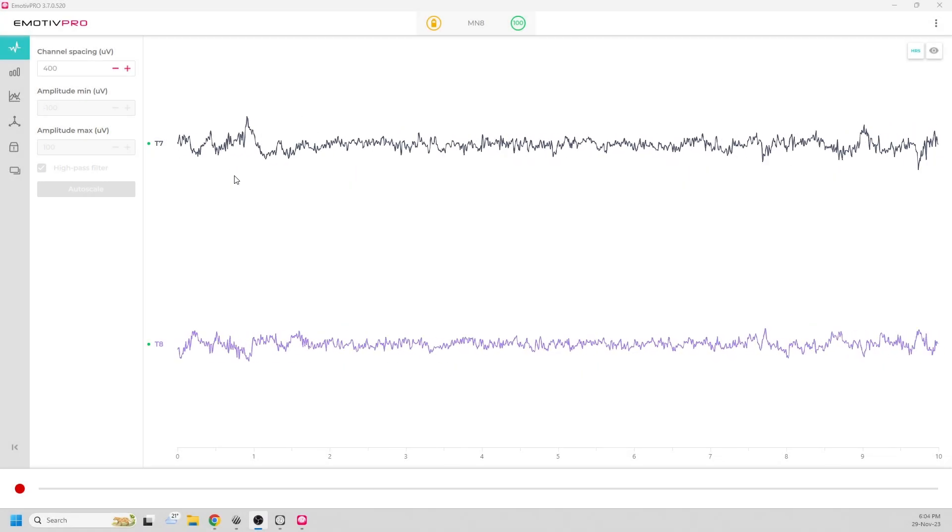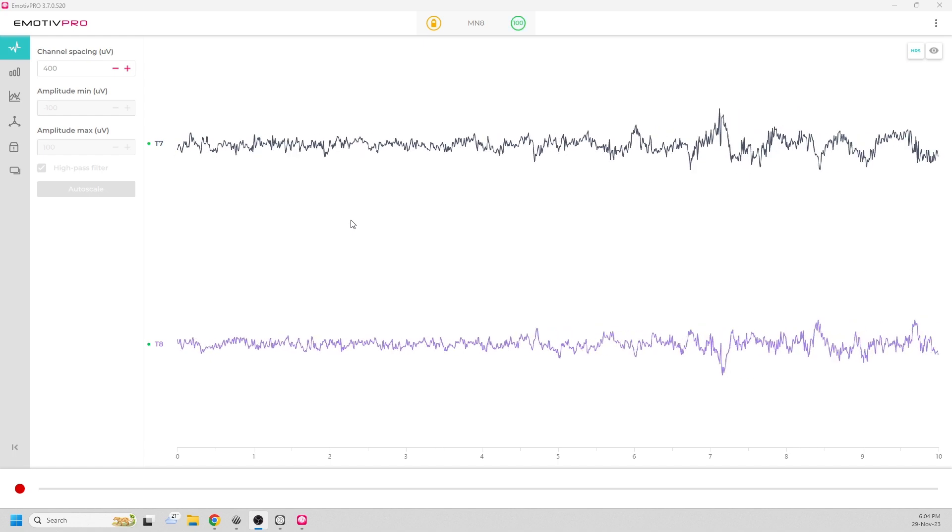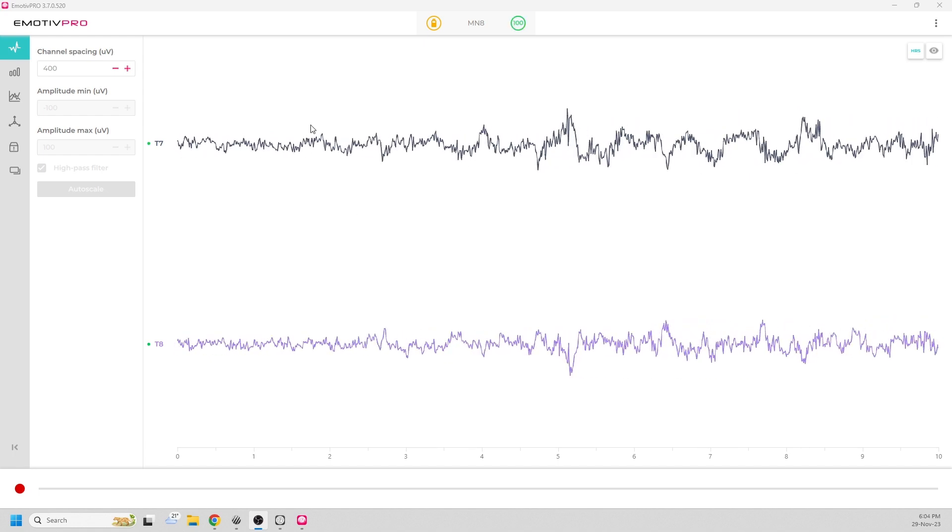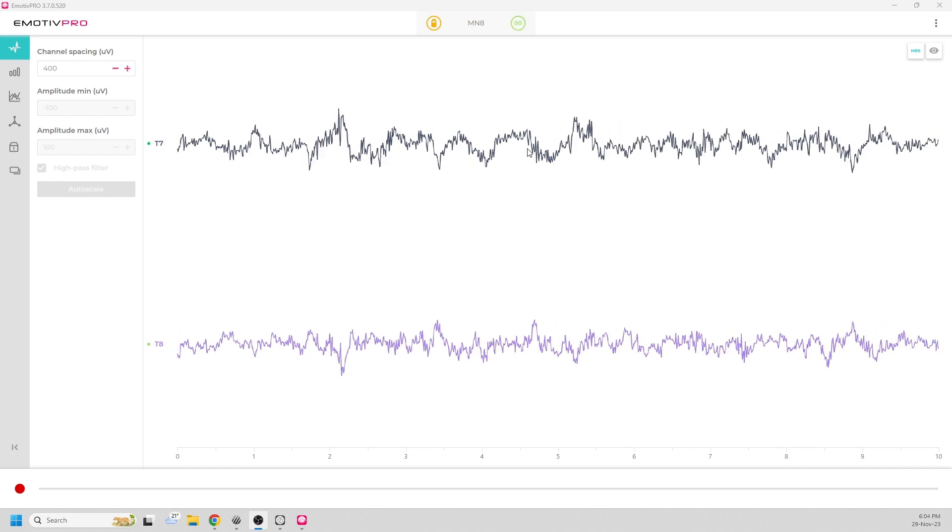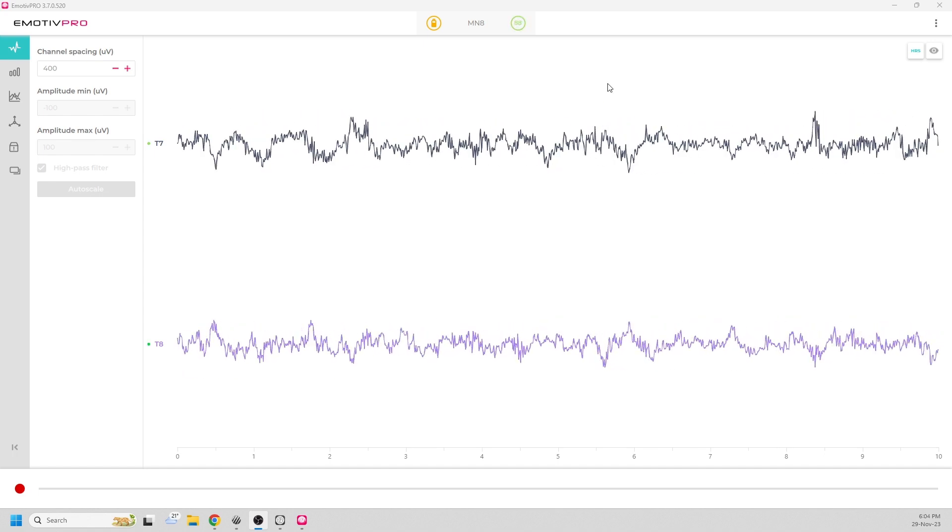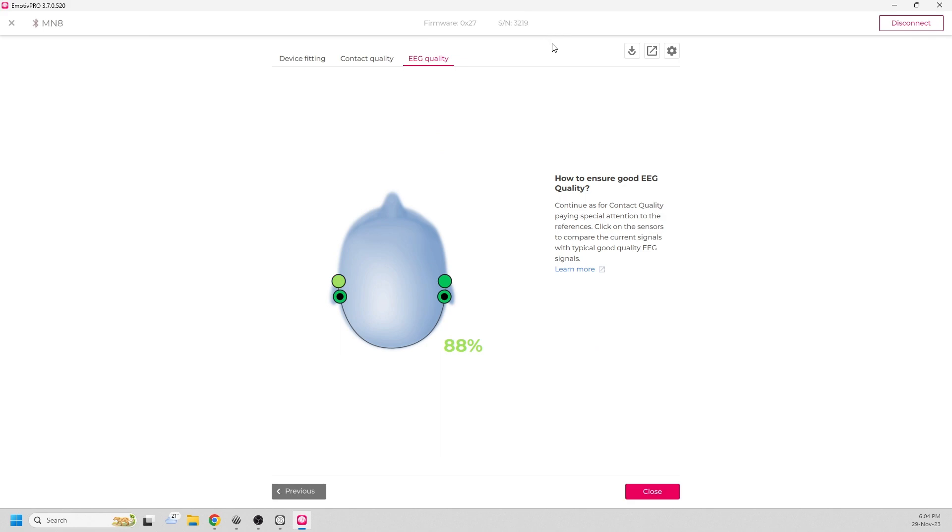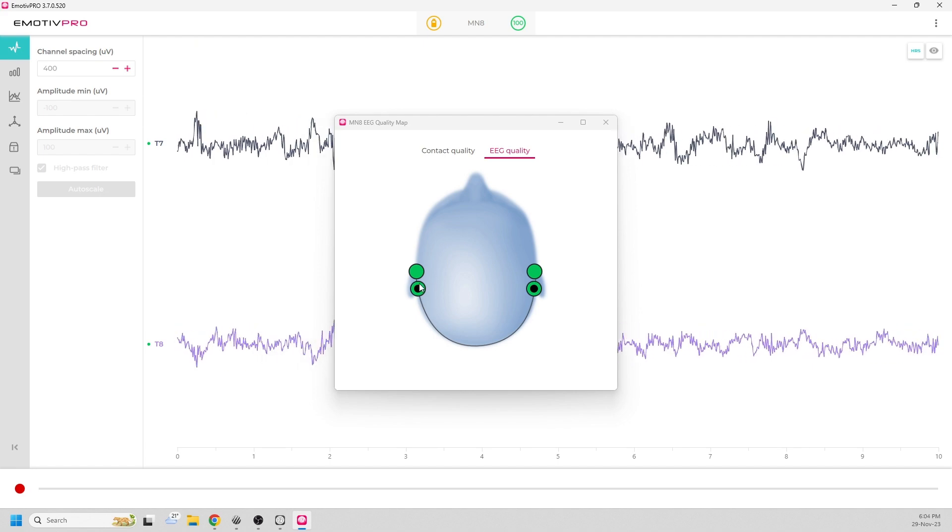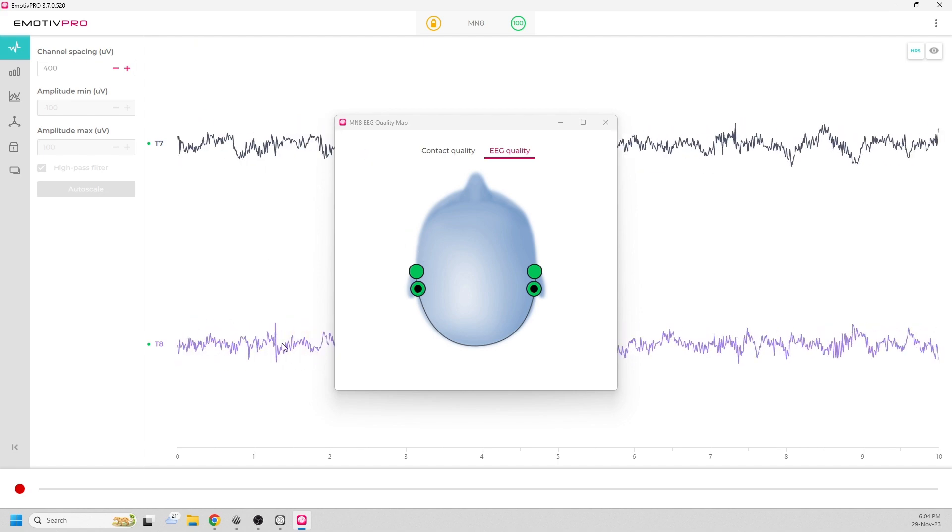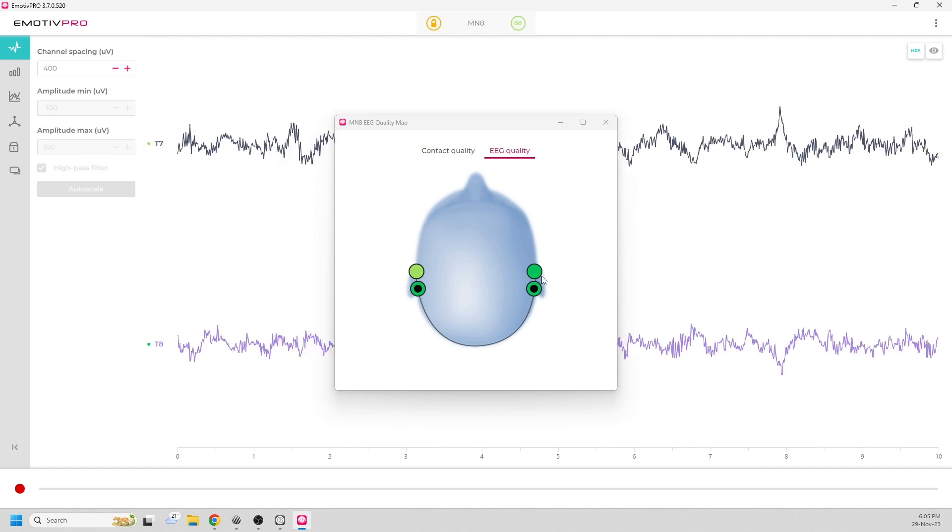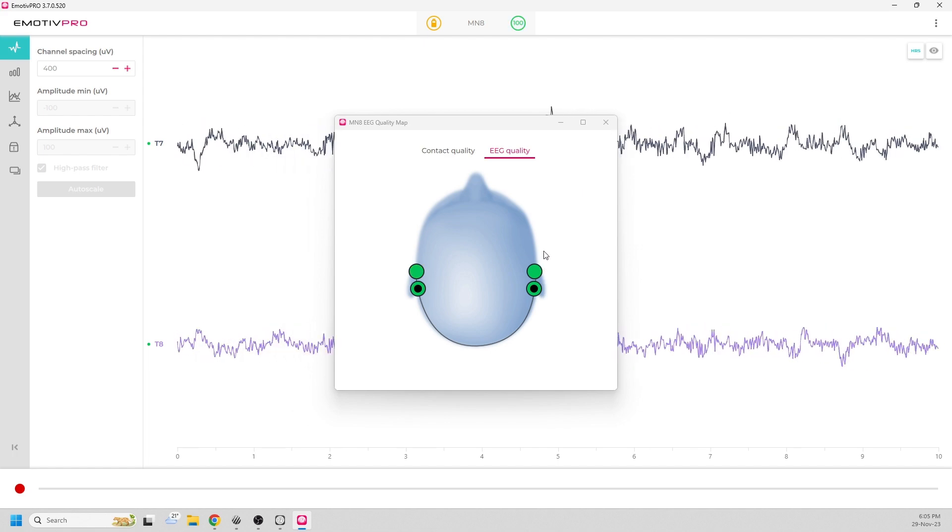Before recording your data, it's a good idea to connect your headset to the Emotive Pro and have a look at the raw signal. You want to make sure there's no unusual noise in the data and you can use the Emotive EEG quality indicator to help you out. You can see here the two channels, T7 and T8 on the MN8 headset I'm wearing, are providing a good signal.